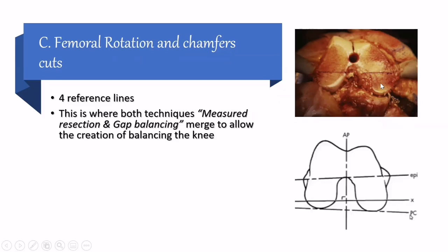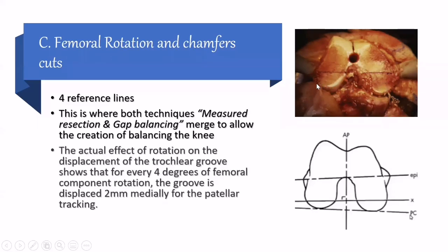Anatomically speaking, the medial side projects posteriorly more than the lateral side, especially in varus, so we can measure these two pieces that we will remove. Gap balancing means that we can use either the tensiometer placed from the tibial cut to the posterior cut of the femur, or the space blocker.